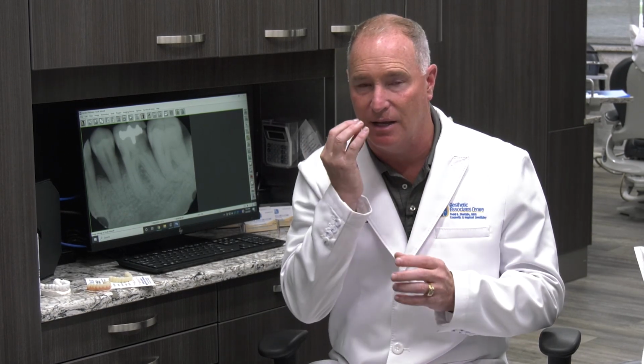I usually use cotton rolls to take the bite, but if you need a bite rim made, you can either make one in the office or send one out to the lab to have a wax bite rim made and have them back in for a wax bite. It's up to you how you do your bite. I usually use a couple of cotton rolls, have them bite down and get an idea of where I want their vertical, and then I take a registration bite on the opposite side and then do the same on the other side. So there's a couple different ways you can do your bite.